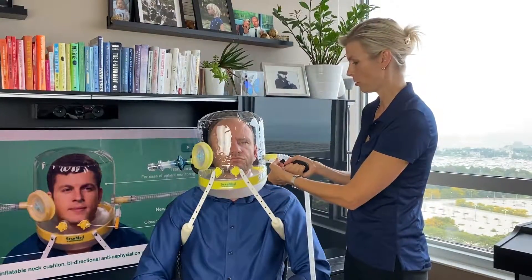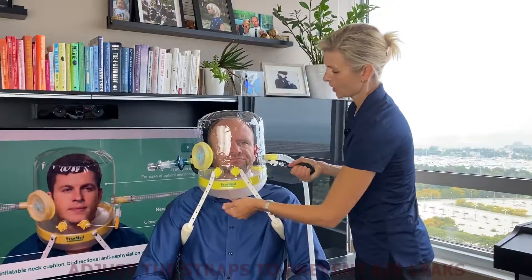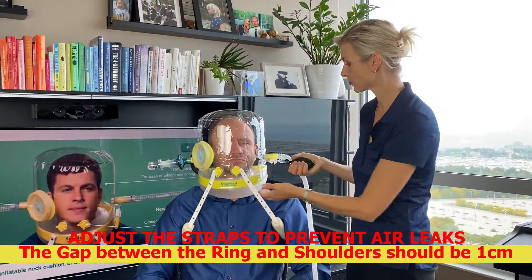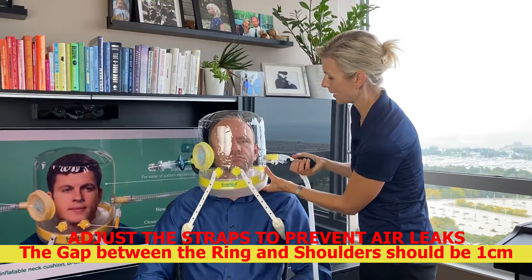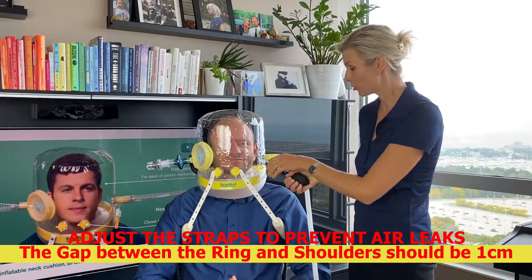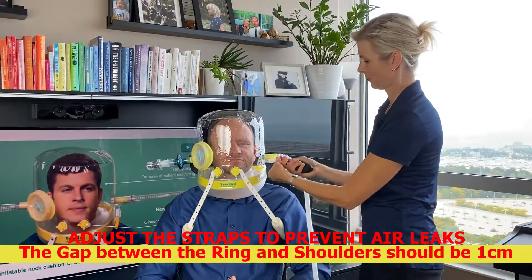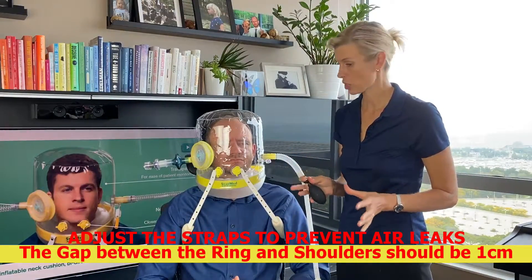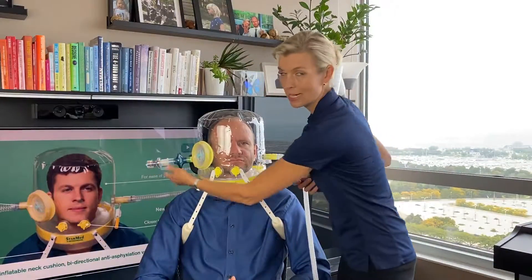To make it more comfortable for the patient and to prevent leaks when you increase the pressure, inflate the pillow. It's very important to talk with the patient, explain what you're doing next, and ask how he is feeling — is he comfortable? Then clamp, remove the bulb, and you can start the therapy. For the PEEP valve, make sure it is set at a minimum of five centimeters of water.